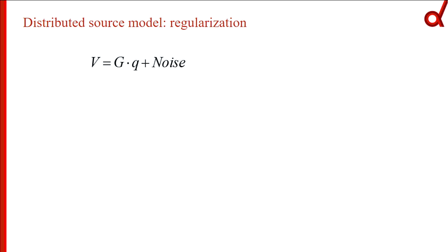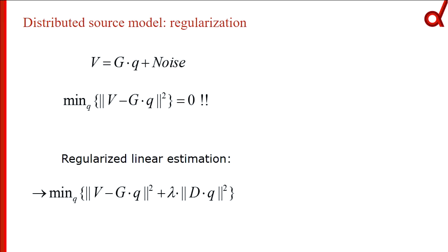So basically the model is: we have the forward model times the source, which explains our data, and we have some noise in there. And that's what we normally want to minimize. The model has to explain the data best. Regularization means we have this additional term with this lambda. I think some fMRI people are already here, so they quite know about regularization. It's this weird parameter, you always have to choose lambda, and then the data gets better or not. It's a little bit of magic sometimes. But in this case, it's quite easy to understand.